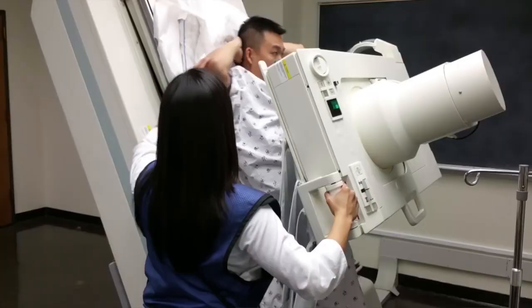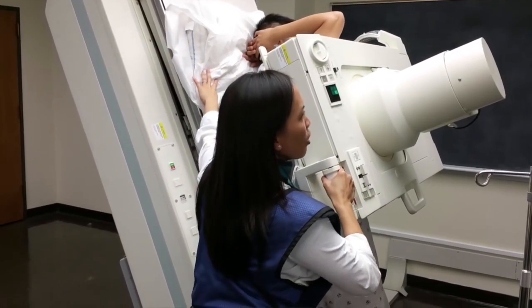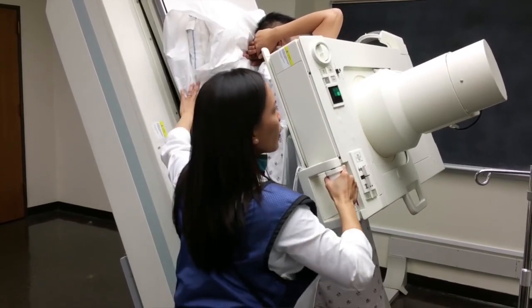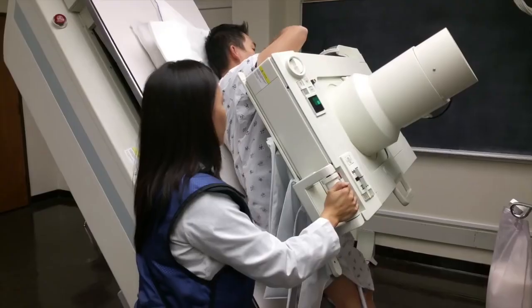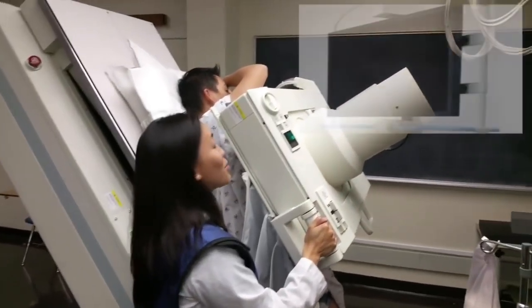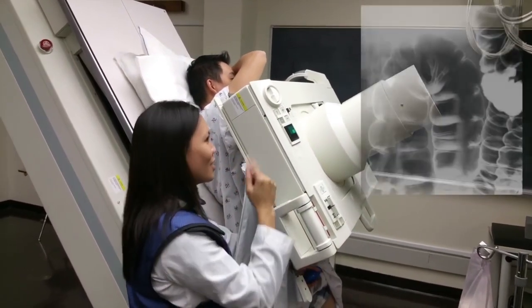You can usually get a nice image of the hepatic flexure with their right side lifted up in a left posterior oblique position. While they're in this position, bring the image intensifier down to look at the ascending colon. You may get a nice double contrast image of the hepatic flexure and distal ascending colon.